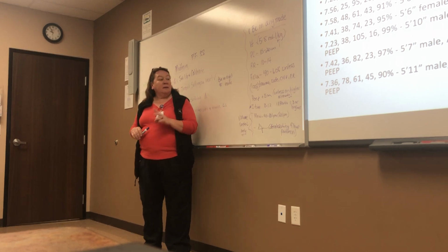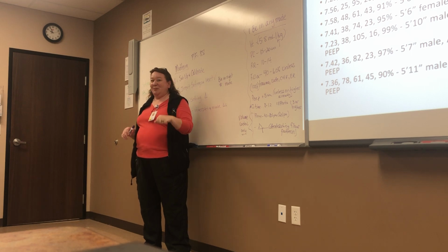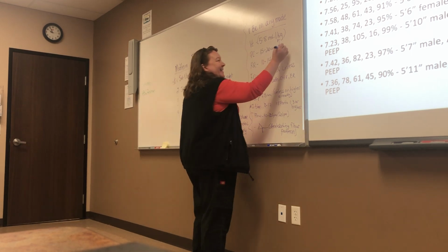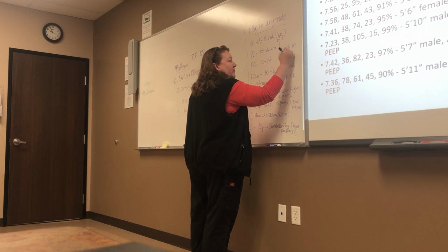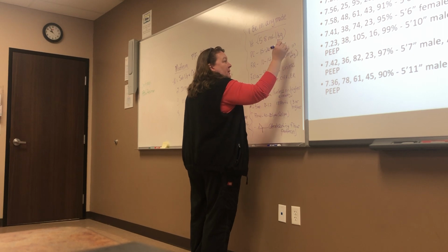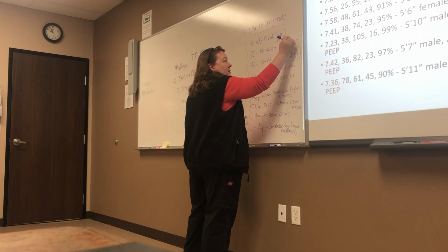And then if I'm in SIMV, what's one other setting I can add? Pressure support. So that could be something else you could set, but only in SIMV. And usually we start at around 5.